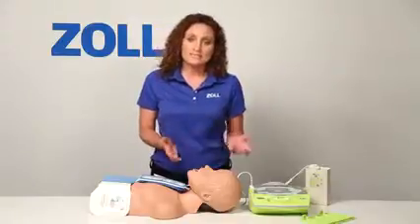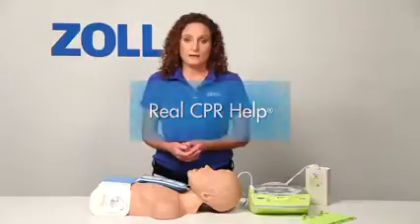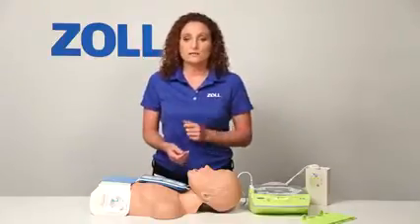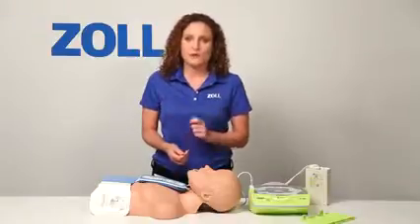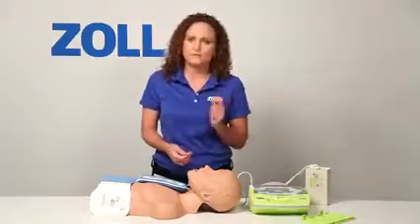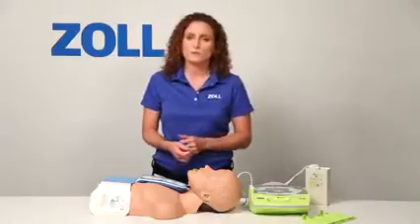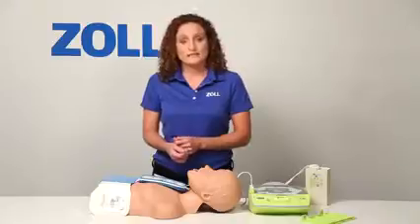As you can see, purchasing the AED Plus gives you real CPR help. It has the lowest total cost of ownership, and it helps in every rescue — not just half the time when a shock is advised. Your rescuers deserve all the support they can get in every rescue, and that's why they need the AED Plus.